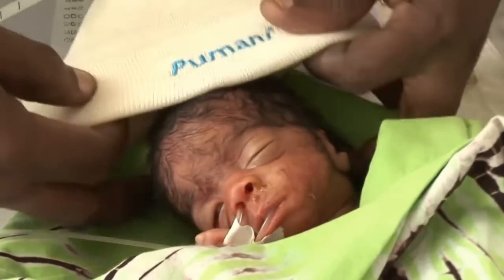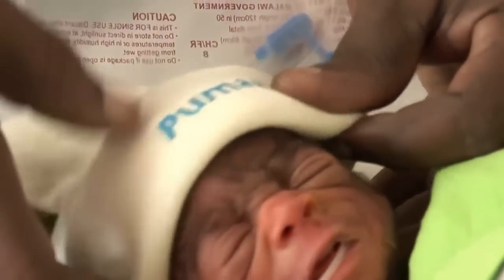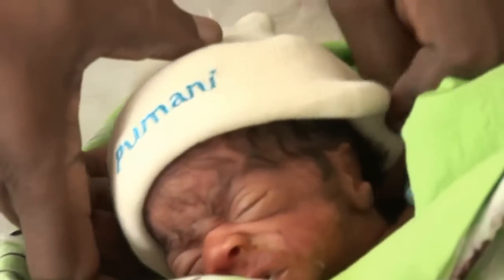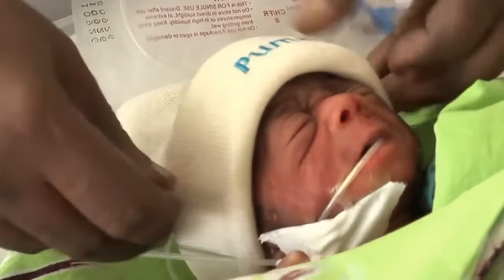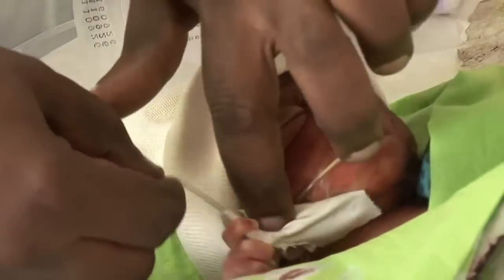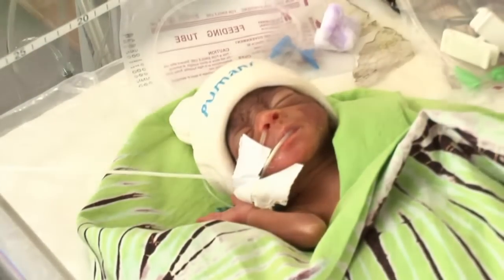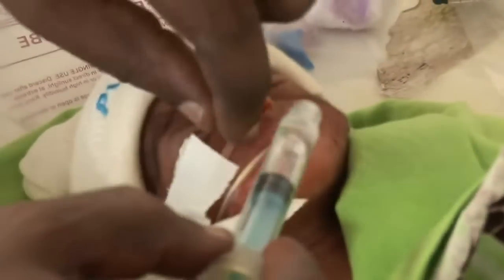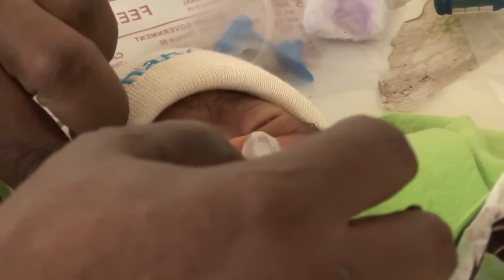It is now time to attach the baby. First of all, put on the hat. Make sure you have everything you need in easy reach. If another nurse is free, it is a good idea to get them to help. This baby keeps pulling out his oxygen, but the ideal is that the oxygen stays in for as long as possible. Only once the hat is on do you take out the oxygen to moisten the nostrils with saline solution.